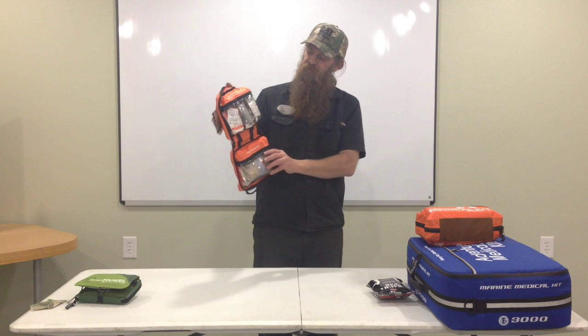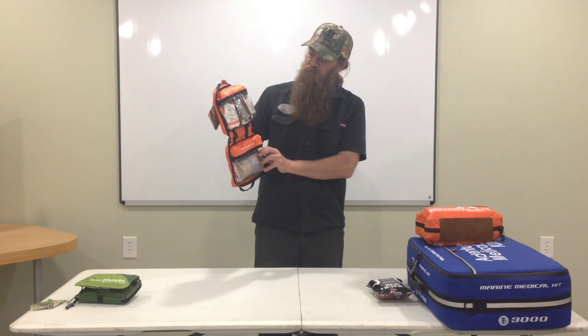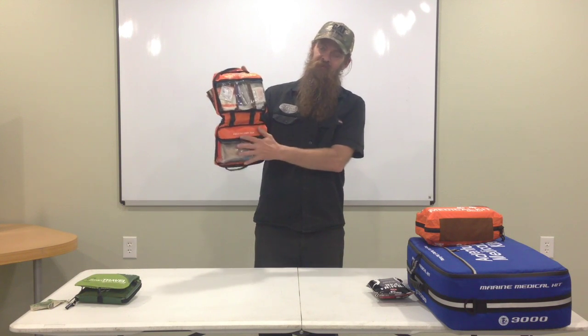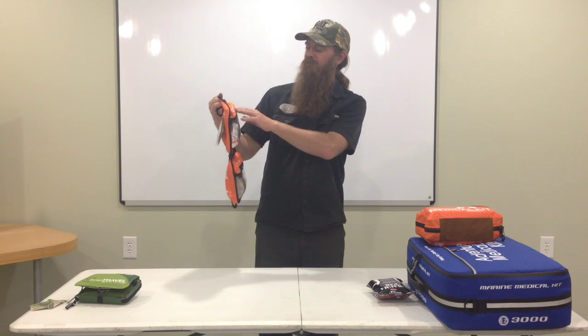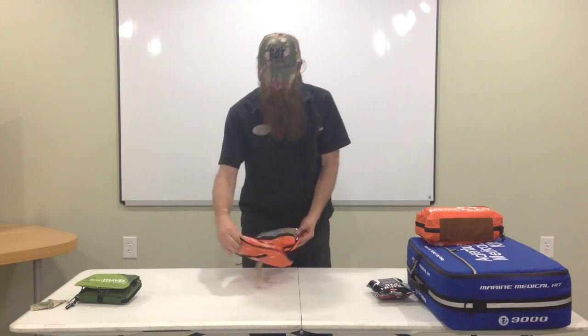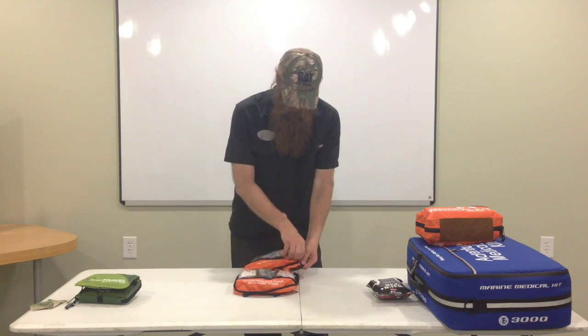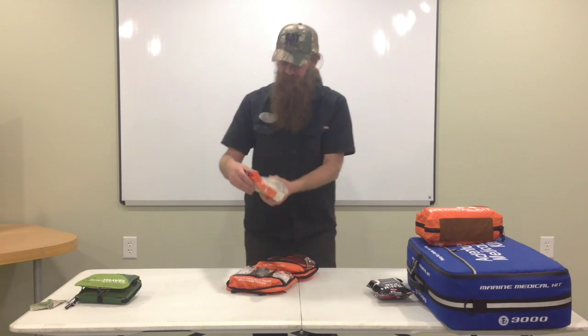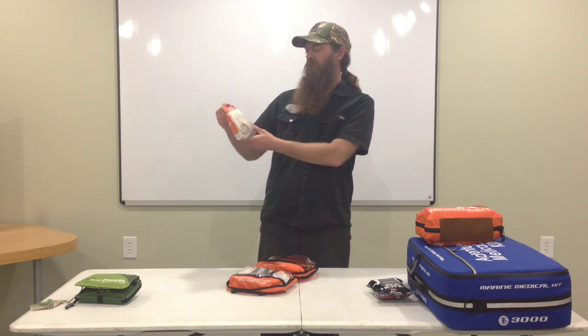It's a decent little kit. It's made so when you open it up, it tells you what's what. It'll have the trauma packet down here, the manual, the medication, the wound care, the burn, and the blister at the top. These are zipper pouches, and this is the trauma pack.